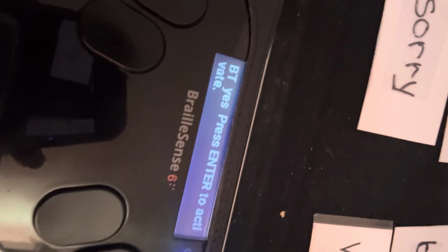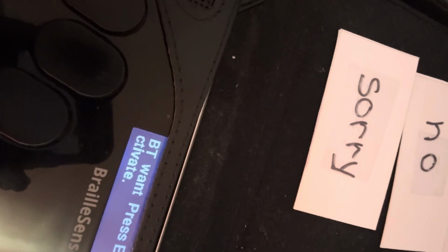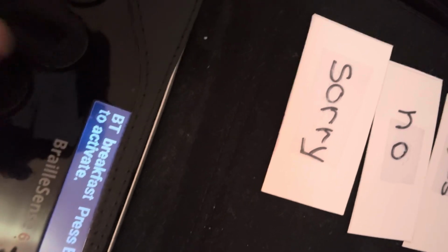But anyway, so scroll through: keyboard, tone, menu, home, yes, quick, he, will, want. Now to say a word, if I wanted to say want, I would click enter on this. Want. So, want, we'll go to food. We'll say want. Breakfast. I'm doing this backwards, but I didn't realize I could hit the S with one finger, or with one hand.